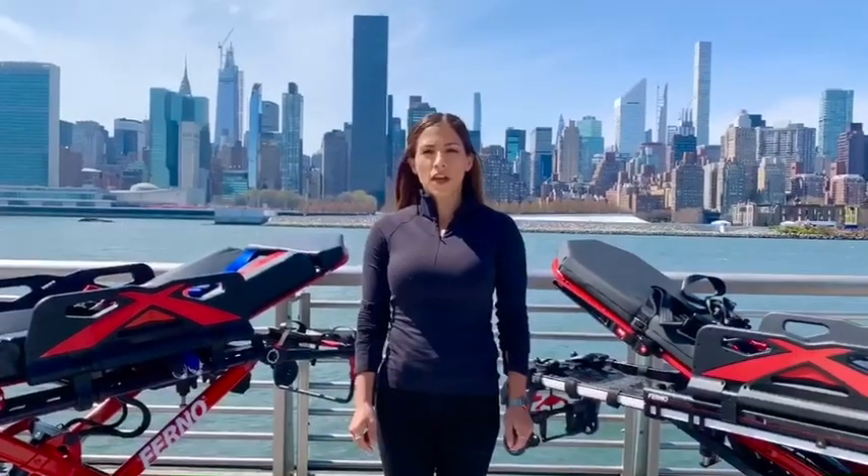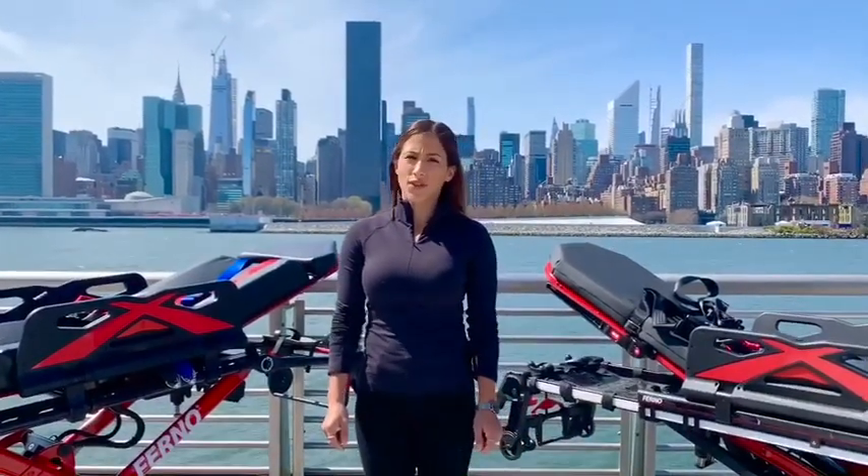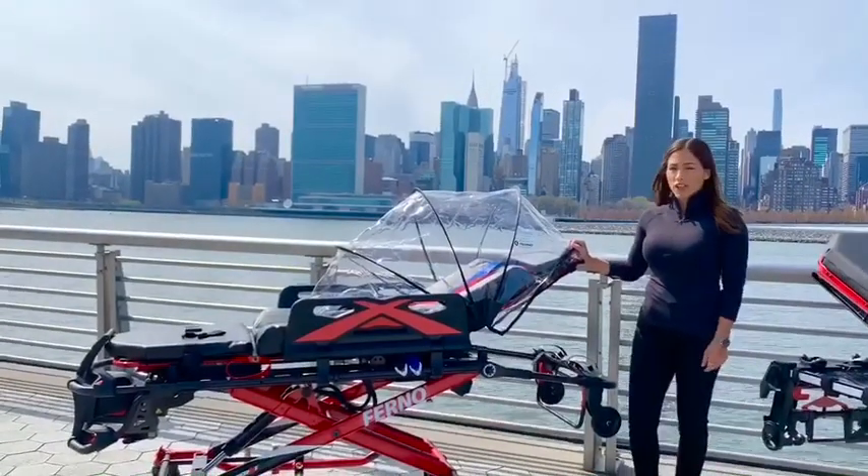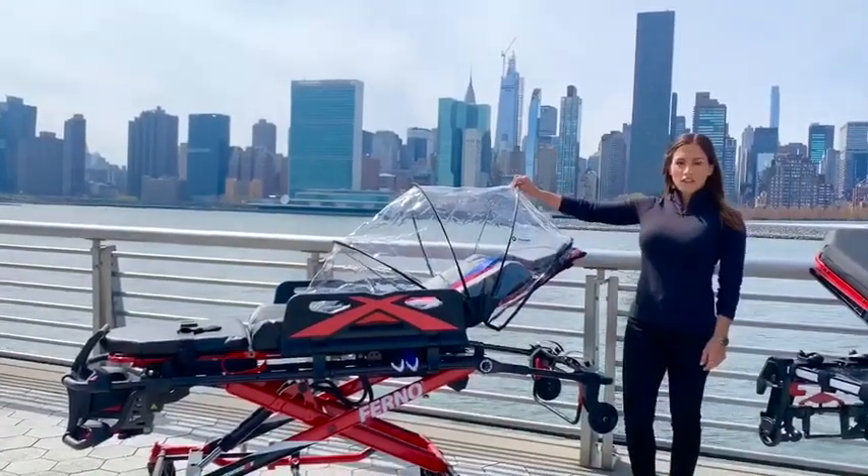Since 1955, Ferno has been creating solutions to increase your efficiency and keep you both — you and your patients — safe in any situation. Today I'm going to show you one of our cot stretcher accessories: Ferno's COVID Patient Shield.